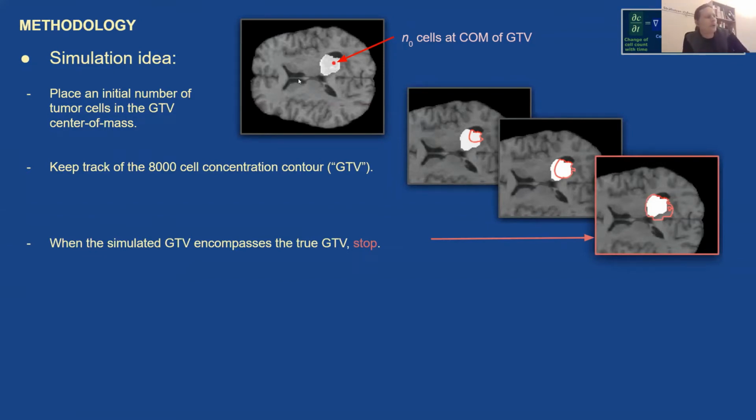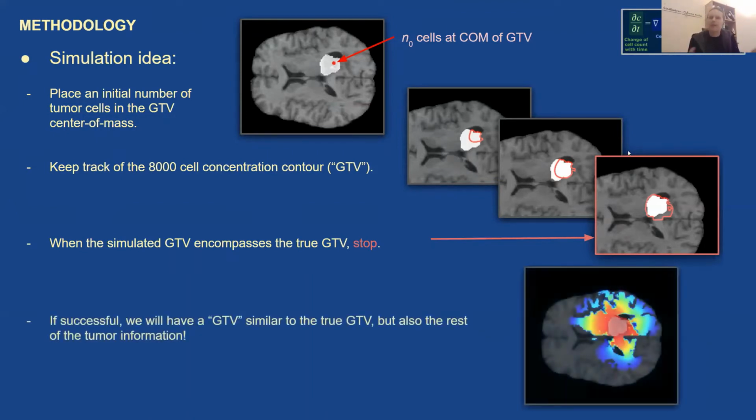So now you might wonder, what is the point of this? If we already have a GTV, what are we achieving by simulating another GTV on top of it? It's not even conforming perfectly. It's overshooting it a little bit, because it always does by definition. Well, you must not forget that we actually simulate the entire tumor. I have only shown you the contour here. So what we get is the full tumor extension. And if we're successful, the GTVs will match fairly well. And then we can start to assume that maybe this tumor extension is like the true value.